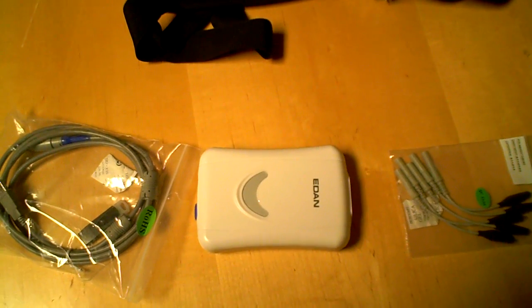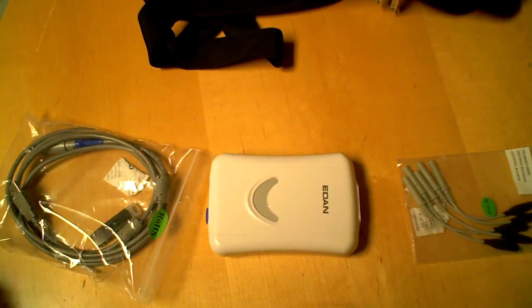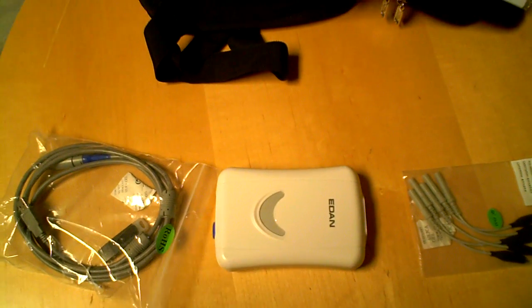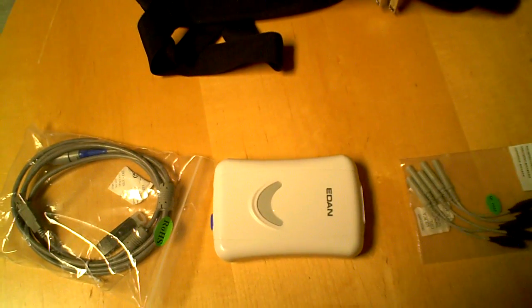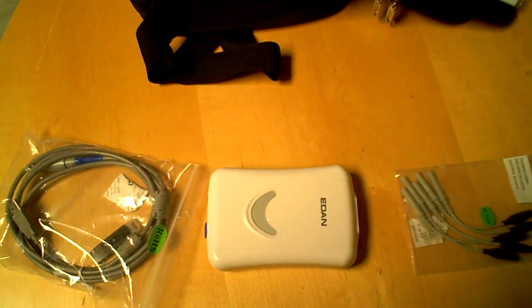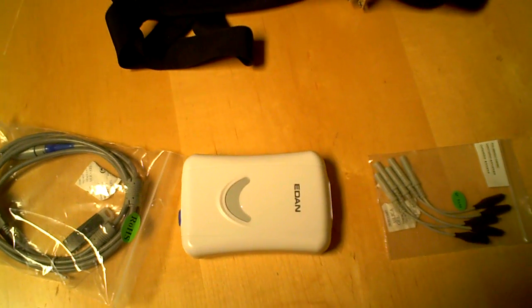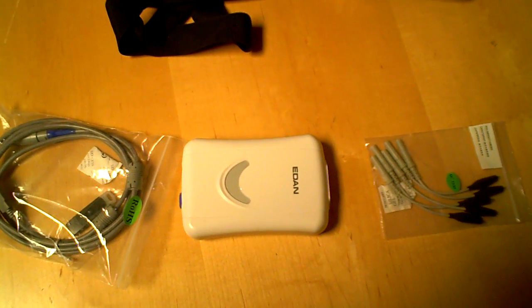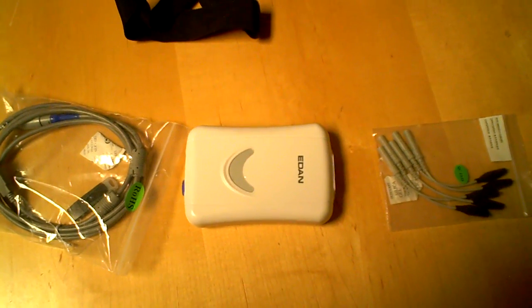However, many physicians might be interested in this type of system because of how compact they are and due to EMR regulations and everything transferring over to electronic medical recording. So we do have access to this particular product, and if a physician wants to go in this direction, we definitely can do so.